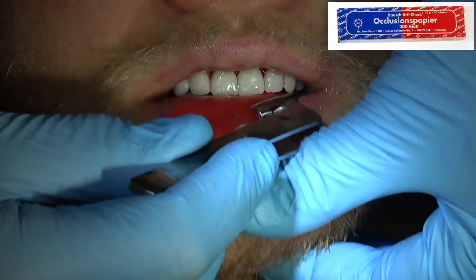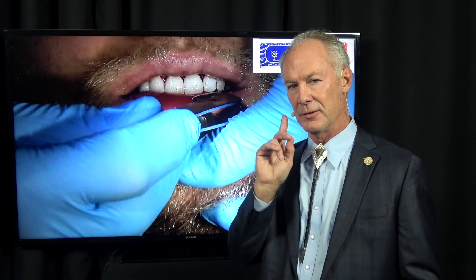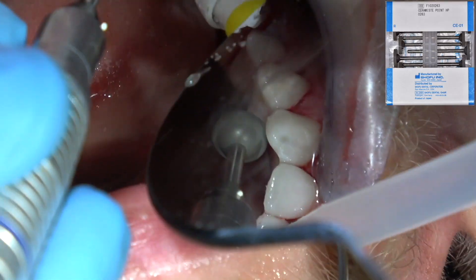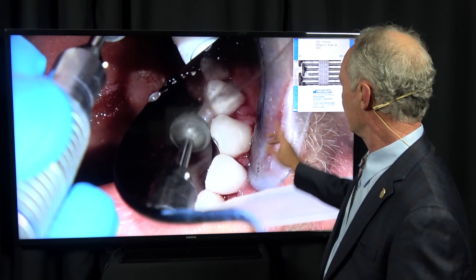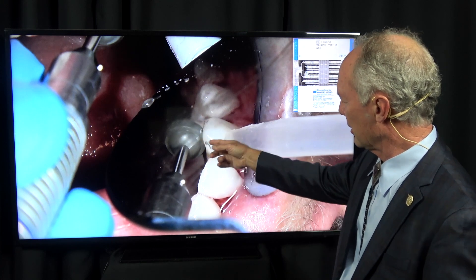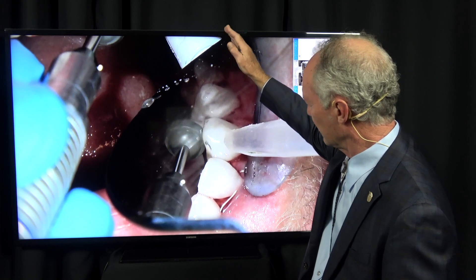Floss. The gingival tissue is going to be irritated right now because you're polishing and flossing — tell the patient it's going to look rough for about a day or two, and don't let that deter them from brushing and flossing their teeth. The gingival tissue is irritated because the patient hasn't been able to floss while the provisionals were on, since they were all connected together. After a few days they'll look just like normal. Then use Shofu rubber wheels to polish the margins and palatal surface of the tooth, turning the wheel from the veneer to the tooth — not from the tooth to the veneer.